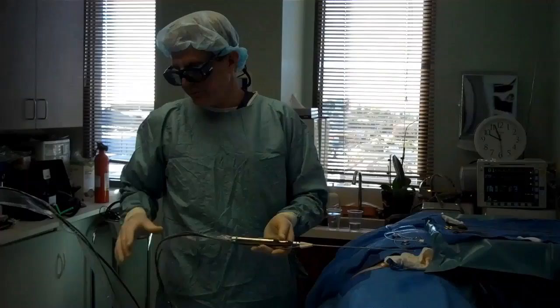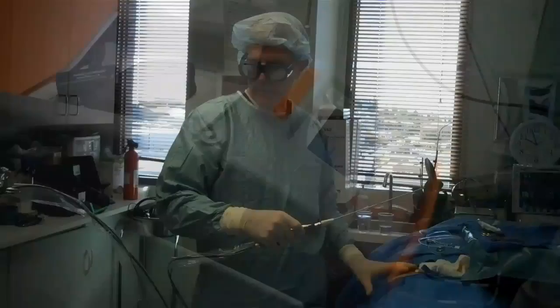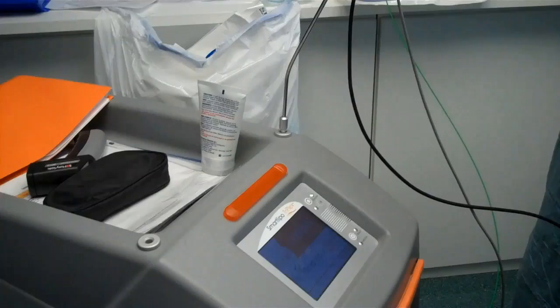This is the SmartLipo, made by Cynosure — it's a SmartLipo Triplex, and this is the handpiece that we use. The laser is here on the end, and I'm going to put the laser on the inside and melt fat — that's the first step. This is the machine; we have a fiber optic cable, this green cable, that's what the laser energy goes through.